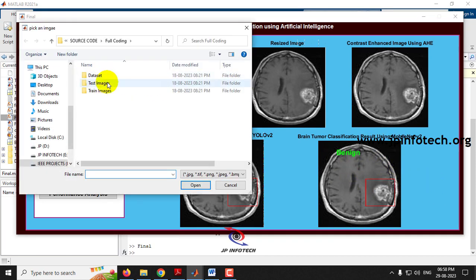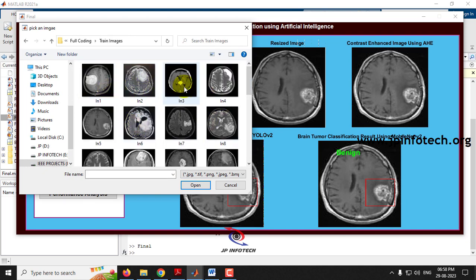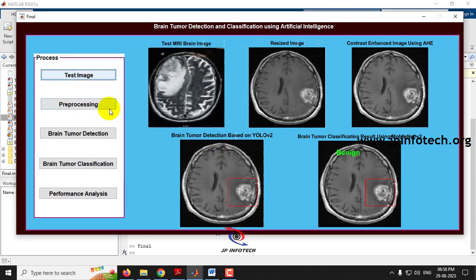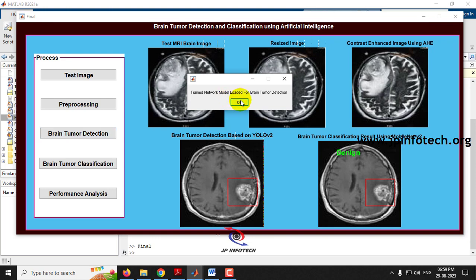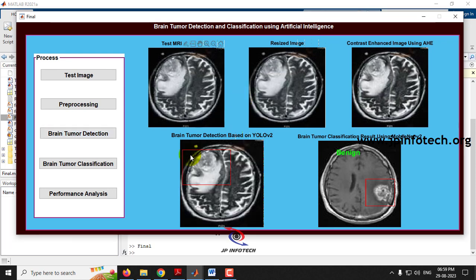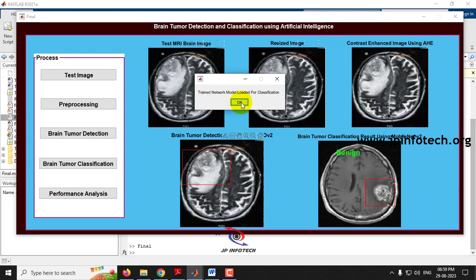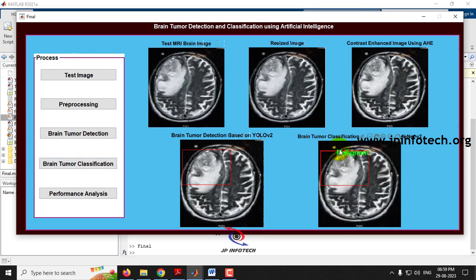Selecting a different image from the train images folder this time: after pre-processing and running brain tumor detection, the trained network is loaded and the detection result is displayed. Clicking 'Brain Tumor Classification' shows this image is classified as malignant. You can check all other images available in the test and train folders in the same way.